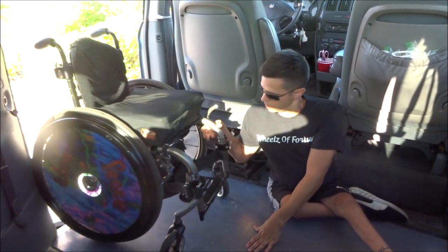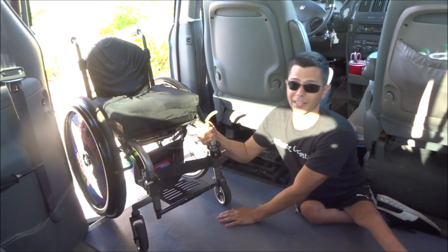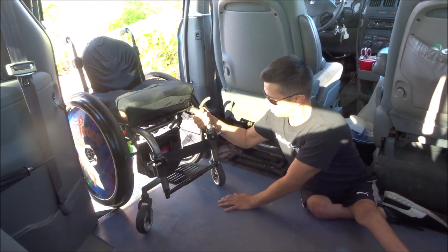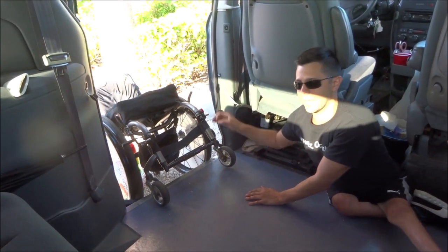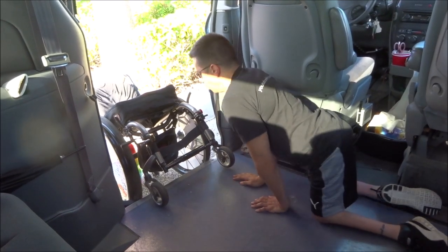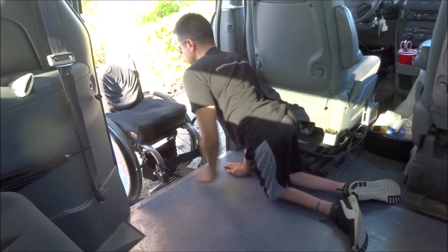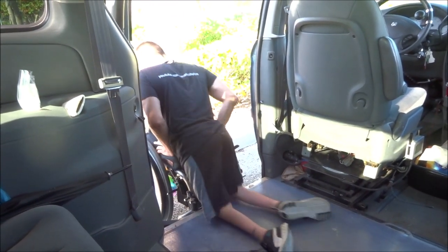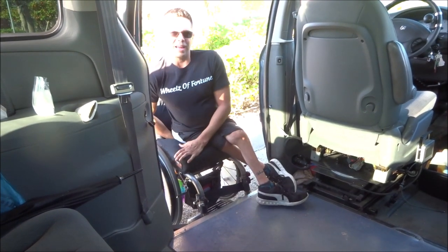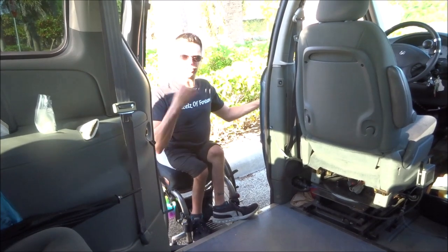I hold this part of my wheelchair with my hand and, as gently as I can, let it down. Once it's resting there, I can push it out the rest of the way and sit on it, then close the door and go on my way.